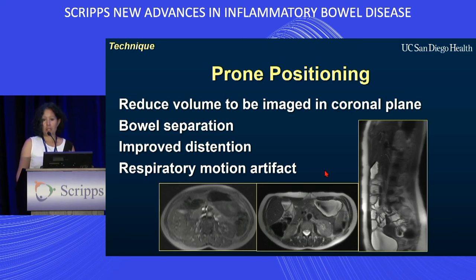I am also a big fan of prone positioning in these patients, and once again, this is something we just need to work together with the patient. Some patients just cannot lie on their stomach for 30 minutes, and that's fine. It's better to image them on their back and allow them to be comfortable and able to do the breath holds as opposed to pressuring them to try to make them get this imaging done in the prone.